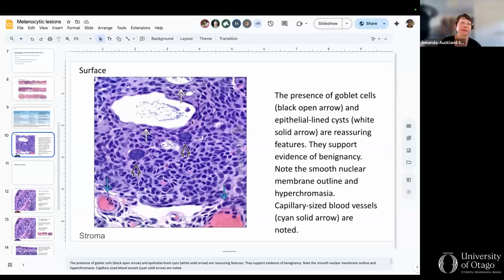Principles, yeah. So if you see these glands of Henle destroyed, you will then know that it could well be invasive. But looking at these cells, they still have the smooth nuclear membrane outline and no nucleoli. So I think that these are probably benign cells. Okay.